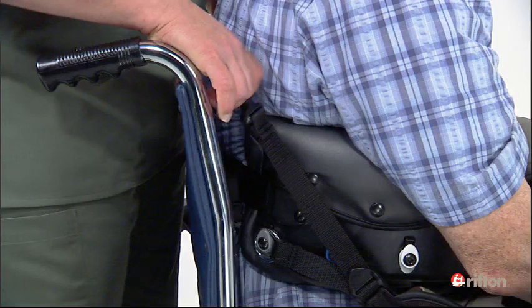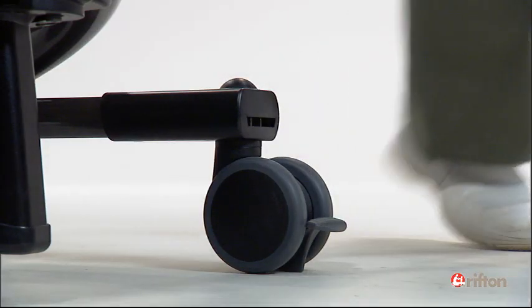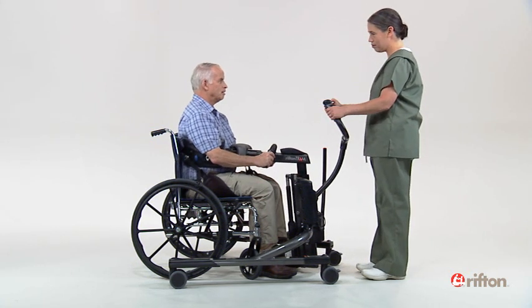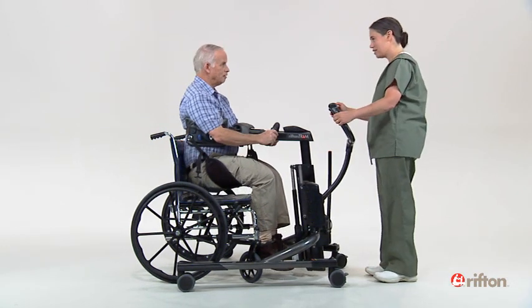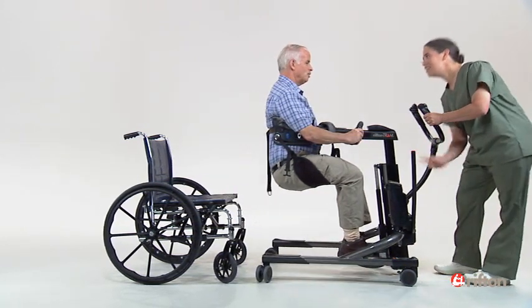Stand behind your client and pull upwards on the adjustment straps evenly. Maintaining eye contact and reassuring conversation with your client, proceed with your lift. If your client appears to sag uncomfortably, lower back down gently and adjust the thigh straps, sliding them further back.